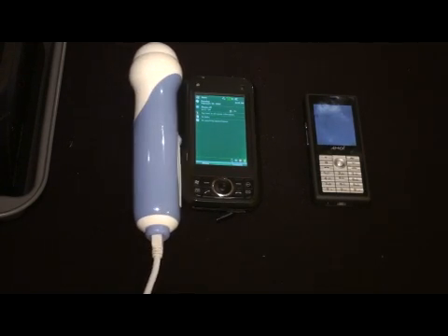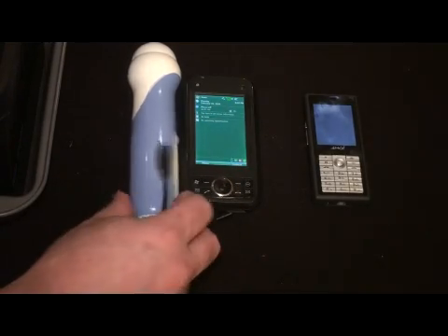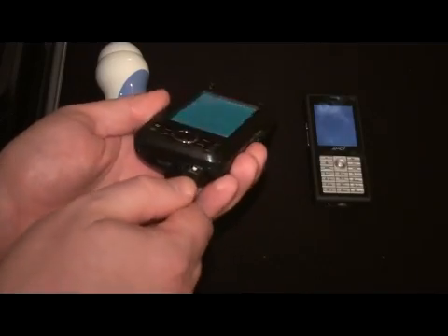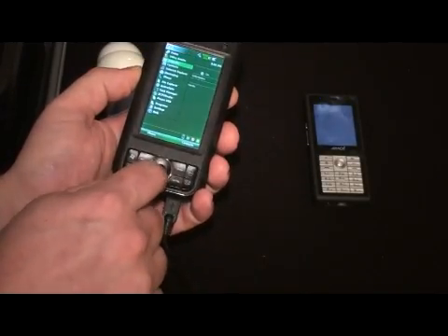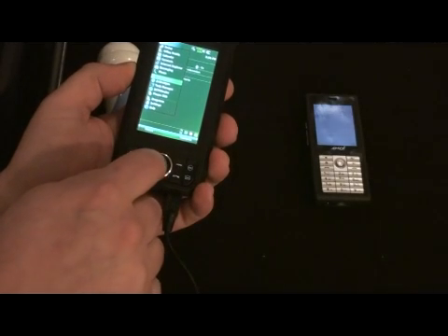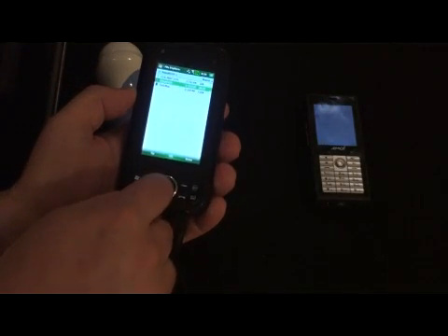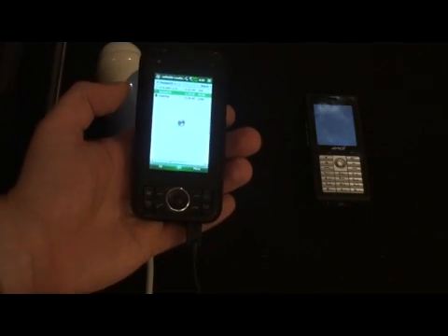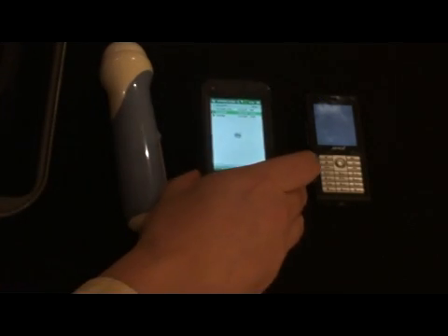What we can do is take the device with a USB cable, plug it into this phone, and then go to where my application is and run our ultrasonic scanner application, which is a Windows Mobile program. I'll let this load.